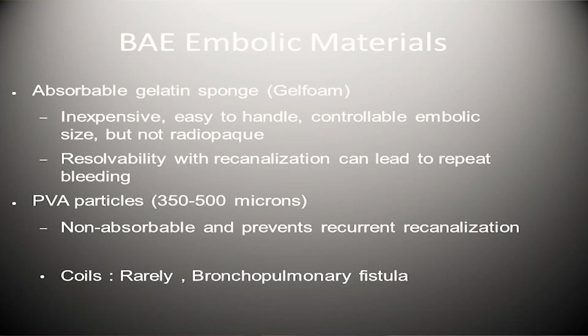One is you can't push coils very distally, and the bleeding is happening distally. Secondly, you put a coil, now you have closed the door, because this person is going to bleed again because you haven't gone distally, and now because of the coil you can't cross that. So coils is last resort. You have to do something, you don't have anything else, then put a coil, but not as a first choice.